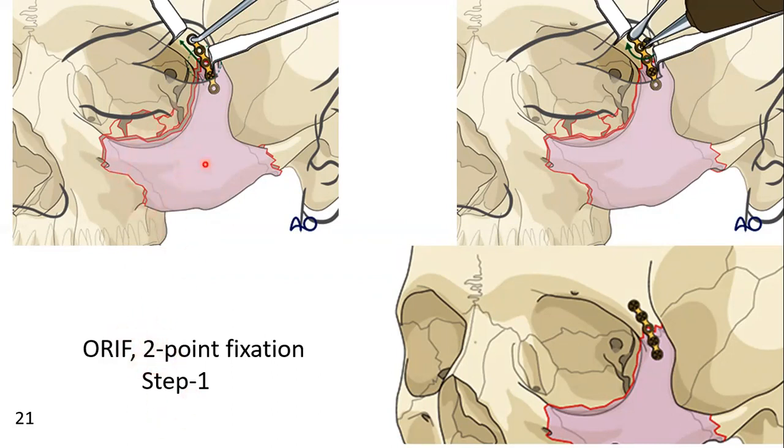So the other point should be reduced properly, and then the final two screws in the zygomatico-frontal plate should be placed at the end of the intervention. It means that you will properly reduce the zygomatic fracture at other points. Then you will finally place the other two screws.